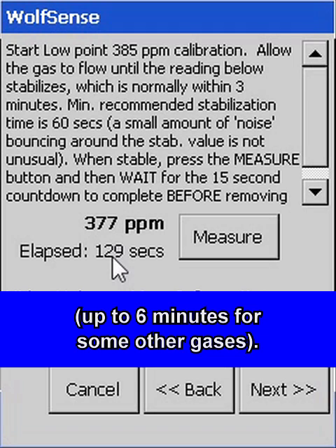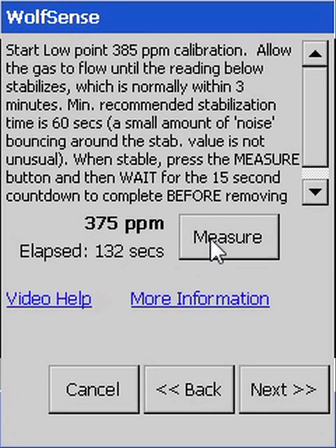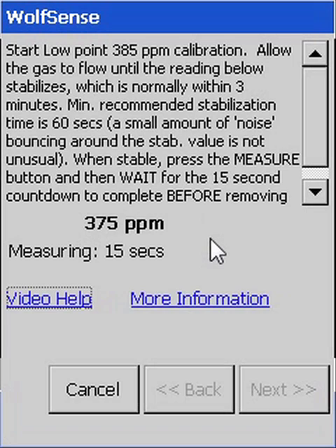Once the gas reading is relatively stable, press Measure. This will start a 15-second countdown over which the readings are averaged. Wait until it is complete.